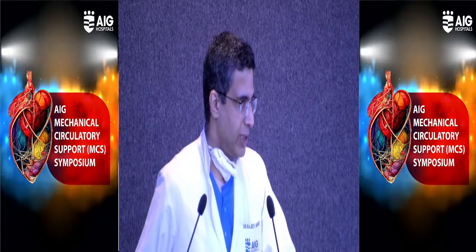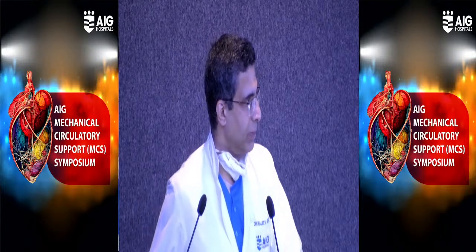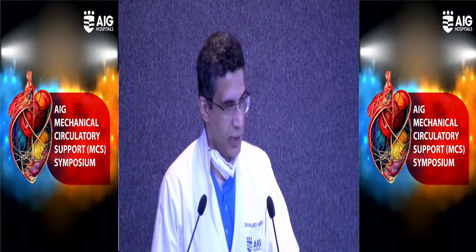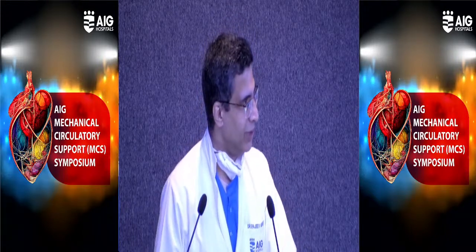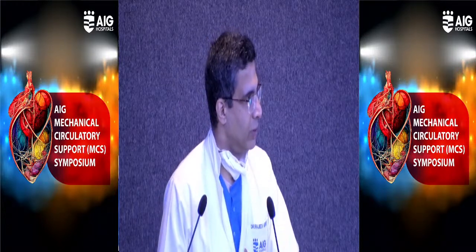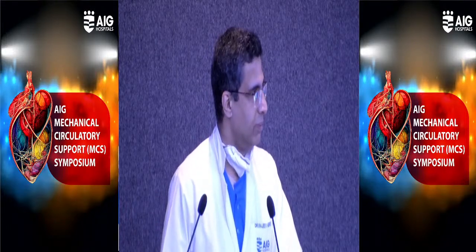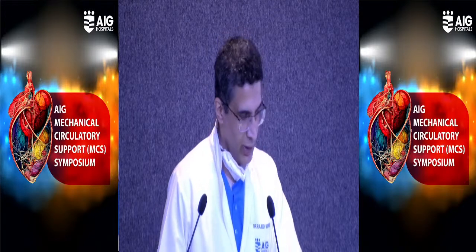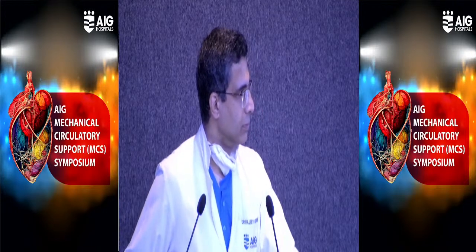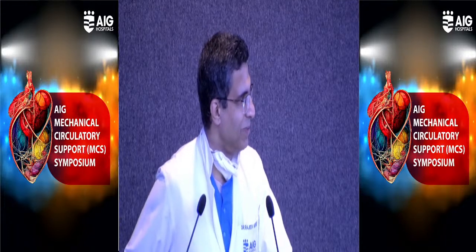But if the patient is hemodynamically unstable, it becomes easy actually, because we upfront put IABP. But when the patient is hemodynamically stable, but as Anuj was mentioning, it's a severe TVD, you're going to open one of the vessels. Do you want to upfront put IABP and then do it, versus finish off the revascularization? You have the advantage that the sheath is there, you just exchange for the IABP. So, yeah, 3 times, both of us operating, we've simultaneously done both together. One doing angioplasty and one putting in the IABP.